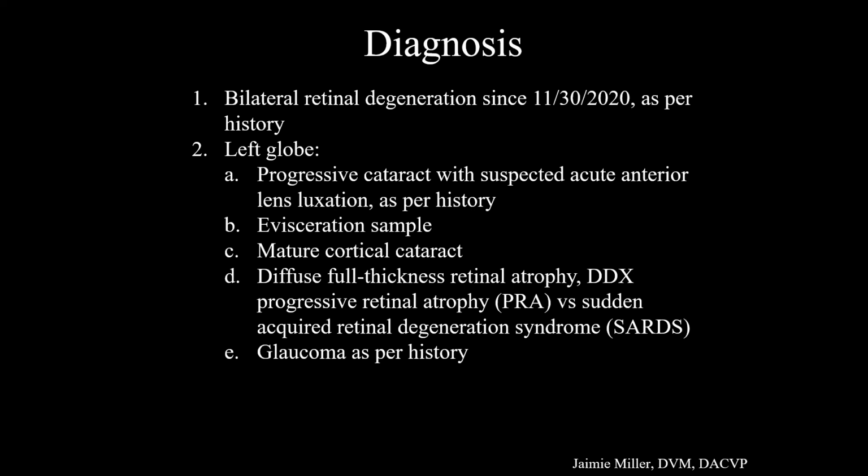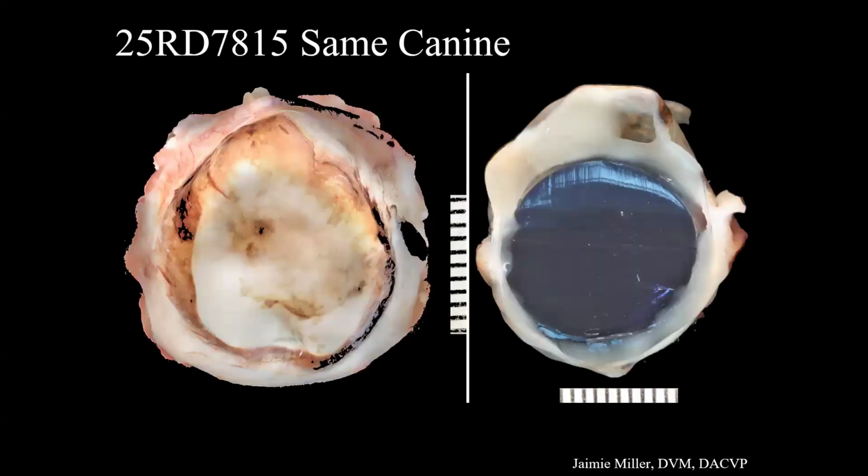Cool. All right. So, this eye, we actually ended up getting the entire eye 3 years later. So the dog was now 10 years old. When they did the evisceration sample procedure, they did put an intrascleral prosthesis in. And then they noted a few years later that they had some clinical changes that they suspected to be nodular granulomatous episcleritis, and that responded to steroids.